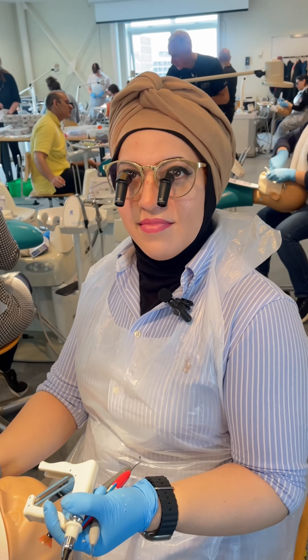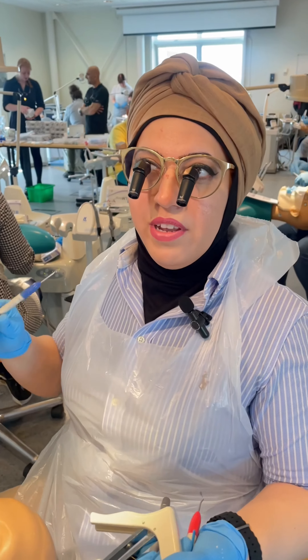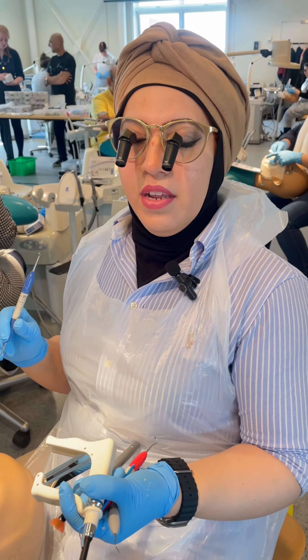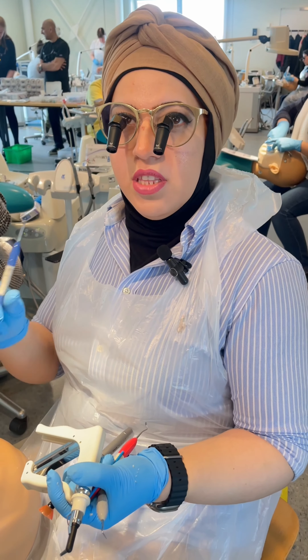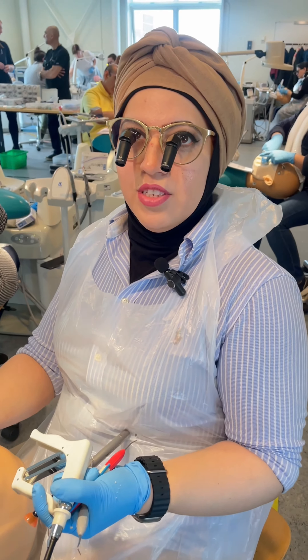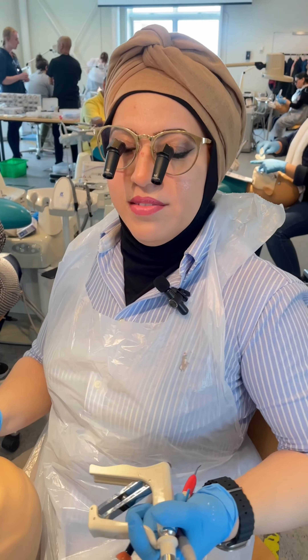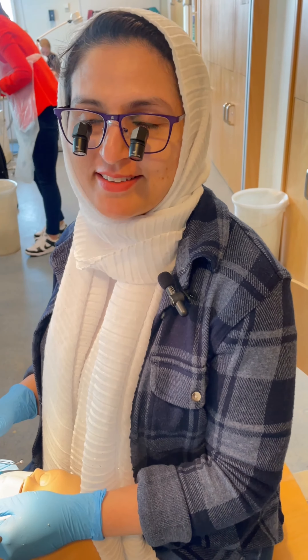How are you finding the loops and what would you say the main differences are? I don't need to bend, so I don't feel any back pain or neck pain, and the magnification — this is 7.2 — it's amazing. I'm like I'm in the tooth. Really, really happy with it. And you think you're definitely going to go ahead with the 7.2s? So much better. Yeah.